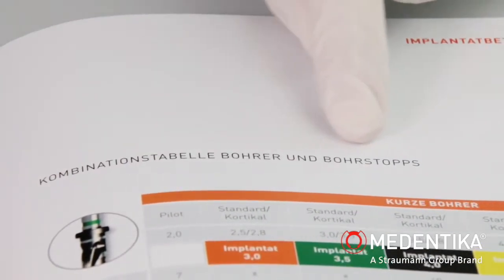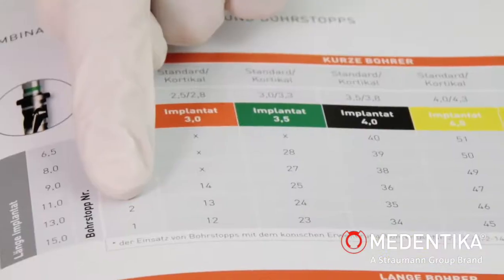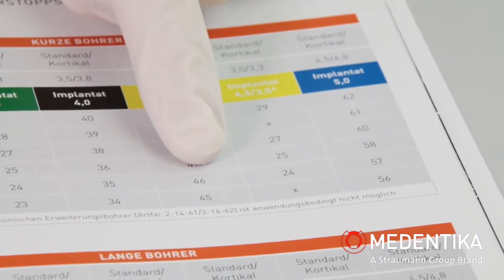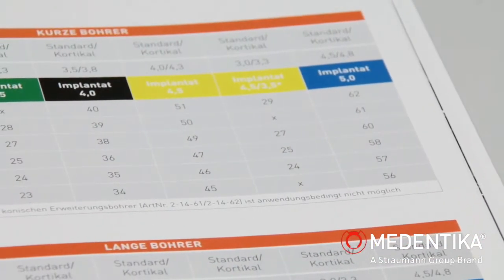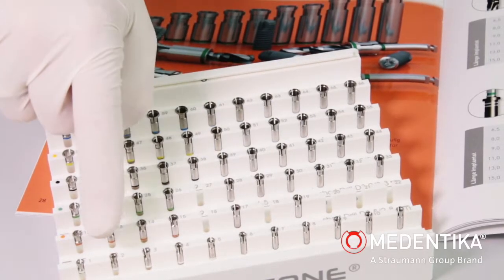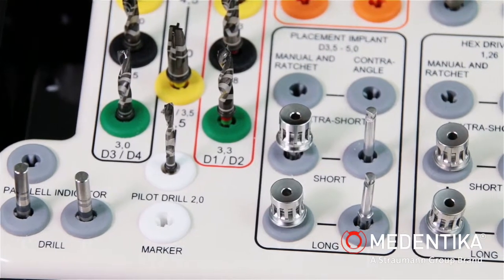A drill and depth stop combination table from the surgical manual can be used as a guide. The number of the depth stop sleeve is derived from the length and diameter of the implant used, or the drill used, and can then be removed in parallel from the depth stop tray. In this case, short drills are used.